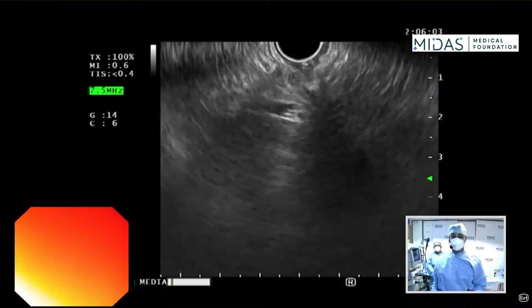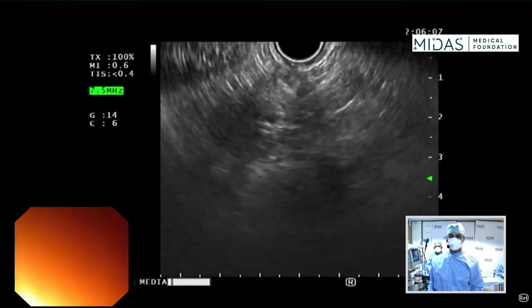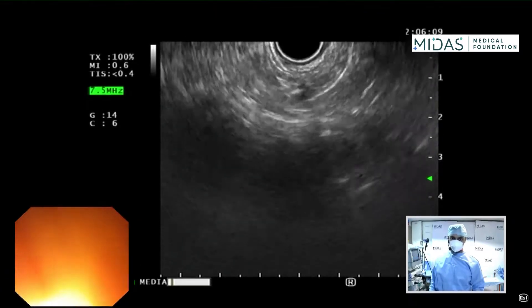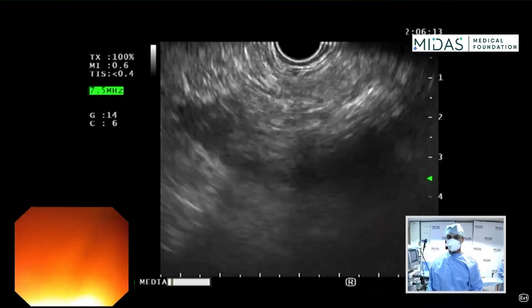We're going to demonstrate EUS-guided FNB of a pancreatic head mass. This patient has a mass in the head of the pancreas and has undergone metal stenting of the bile duct. We are going to perform the EUS FNB today.